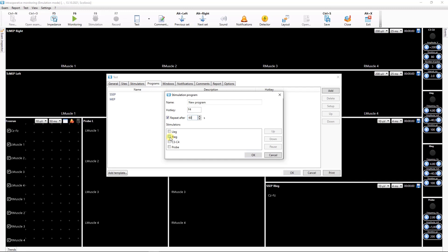In the Stimulators list mark Stimulators that will be used in the given program. The Stimulators will run one by one. To change the order of Stimulator activation use up and down buttons.